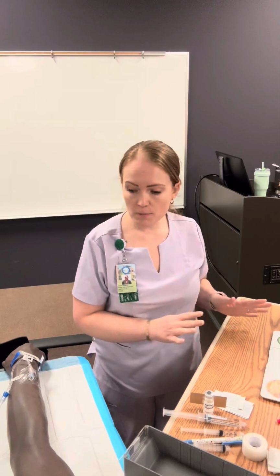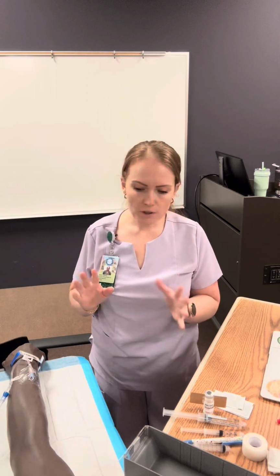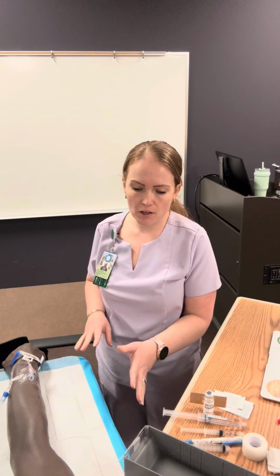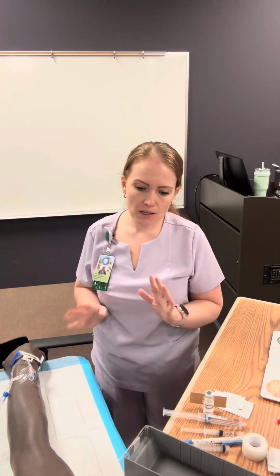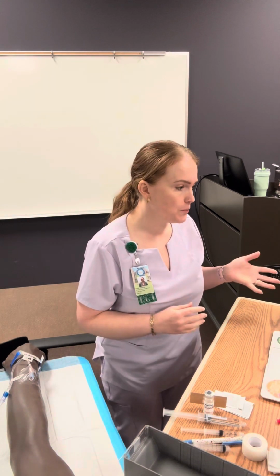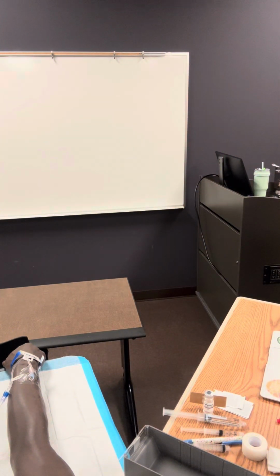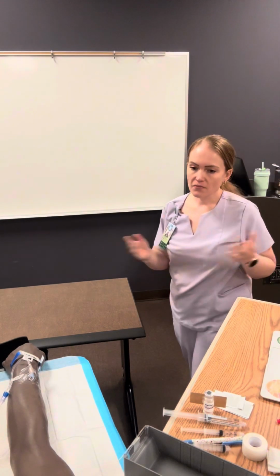Okay, I have documented, I have cleaned up my area, the infusions are going. I'm going to move the client into a safe position, ensure they have the call light and side rails are up, and I'm going to exit the room and pretend like the time has passed and their infusion is complete. Knock, knock, knock.